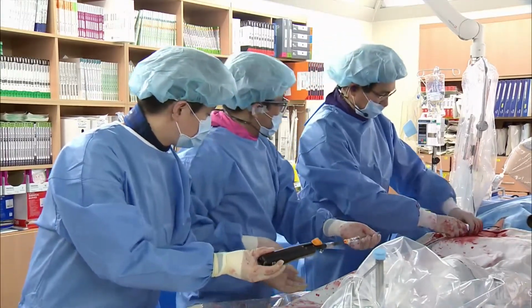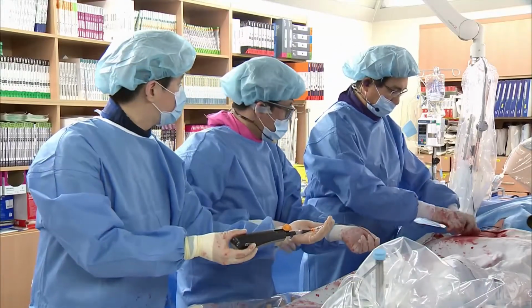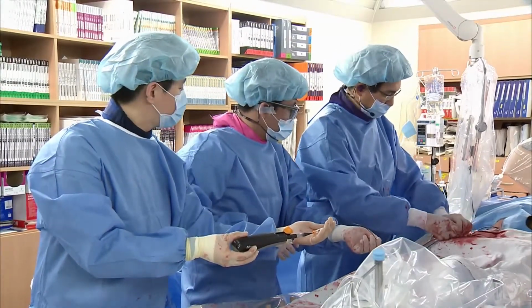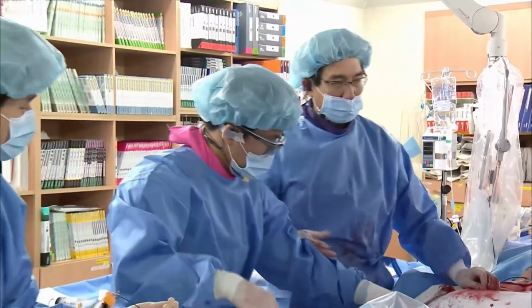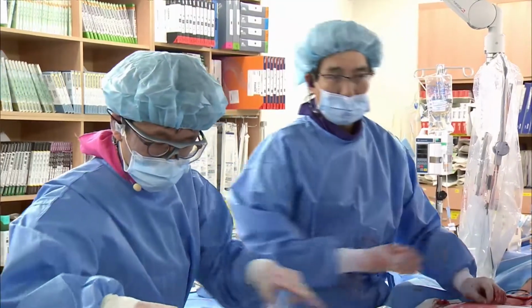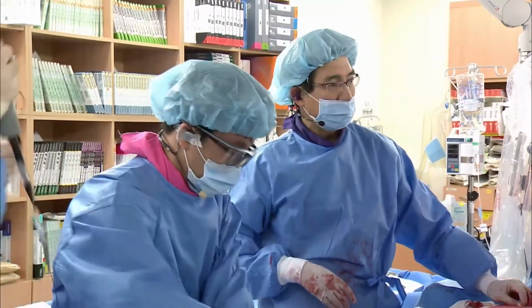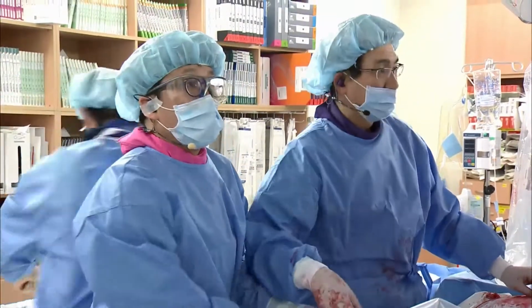Okay, thank you. I'm Hiroshi Ando from Saitama, Japan, and it's a great honor to be given this opportunity. So with me, Dr. Lee will help me this time. And could I have a case presentation? Okay. We'll introduce our case here.